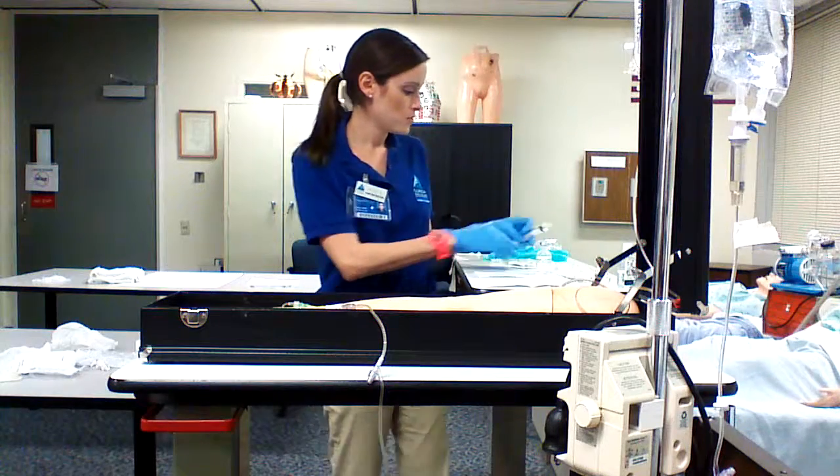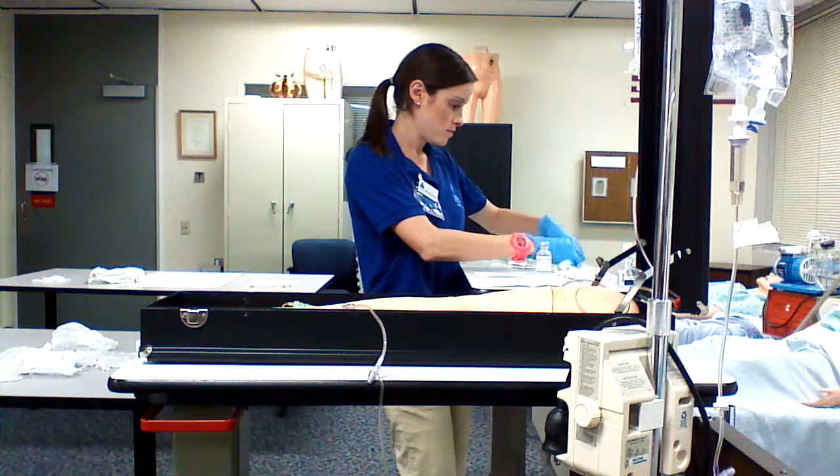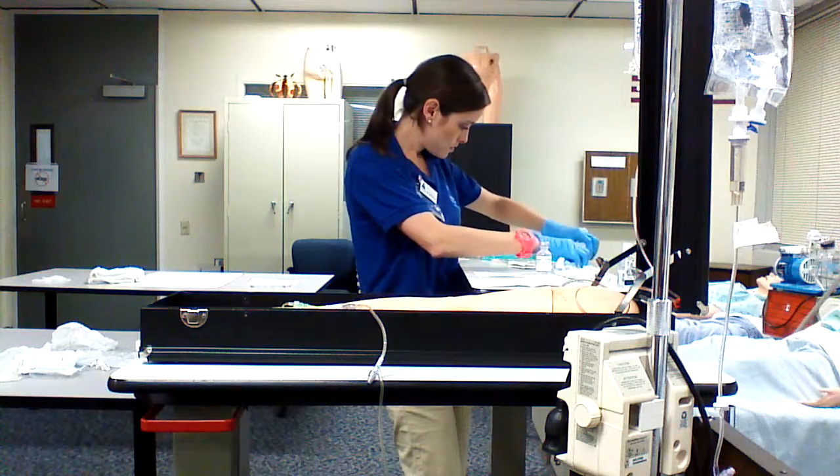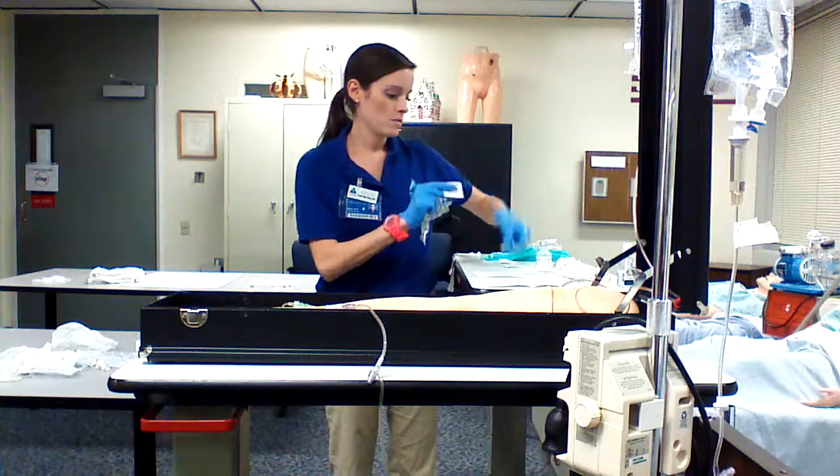Okay, so I have my medication. And I'm going to use aseptic technique to wipe the port.